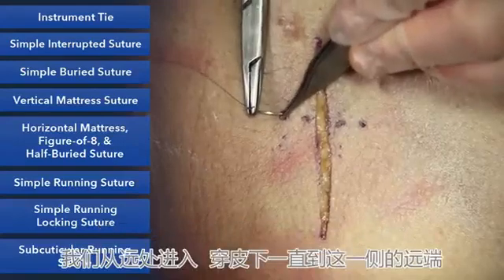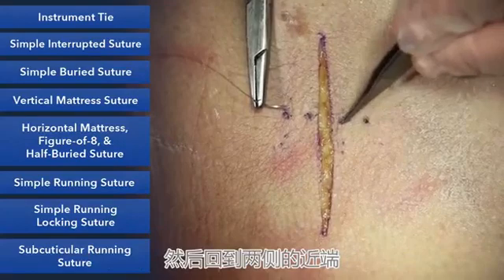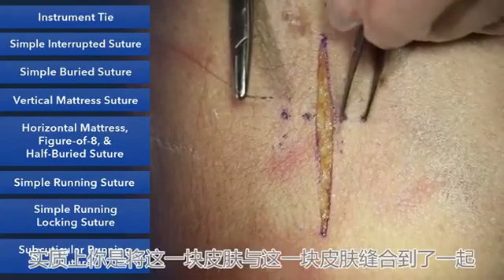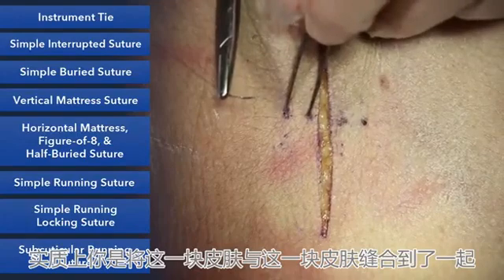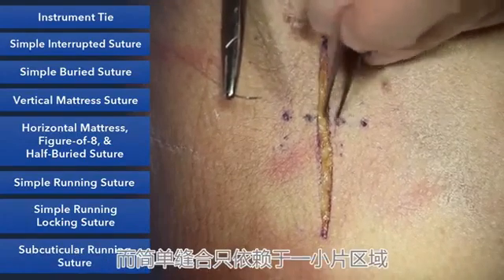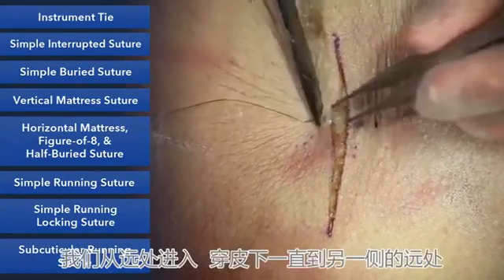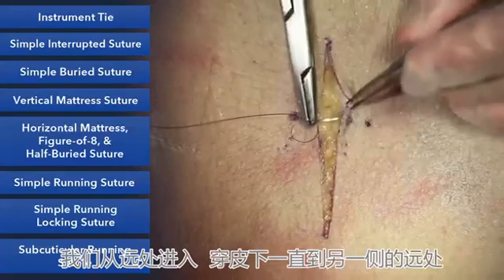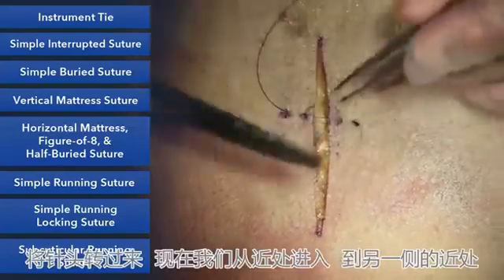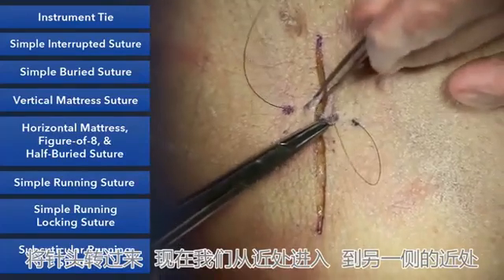We're going to enter far from the wound, travel under the skin, come out far, and then come back and go near, near. Essentially, you're taking this part of the skin and closing it to this part of the skin, and that's the power of the suture. The simple suture is really relying on a much smaller area. So we'll start far and travel under the skin, and the same thing on the other side, and we'll turn our needle around, and now we'll go near and near.